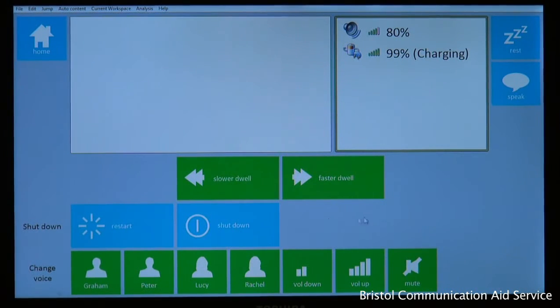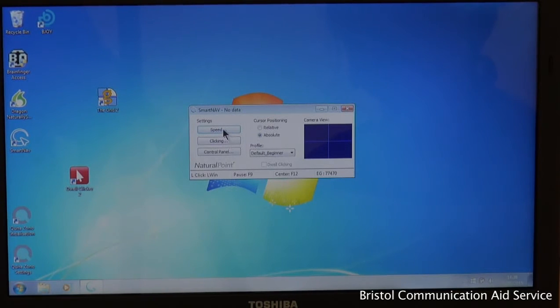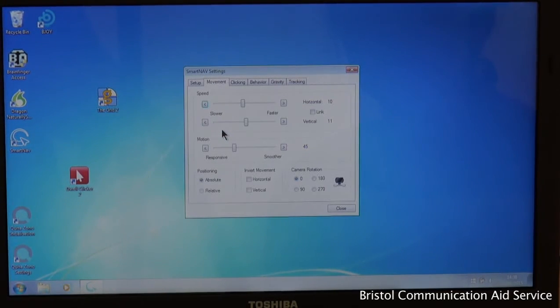To change the cursor tracking speed, click on the Smart Nav icon then select speed. Speeding up the horizontal setting allows for smaller head movements side to side. Alternatively, slowing down can balance an over-sensitive cursor. Vertical movements can also be adjusted to suit.